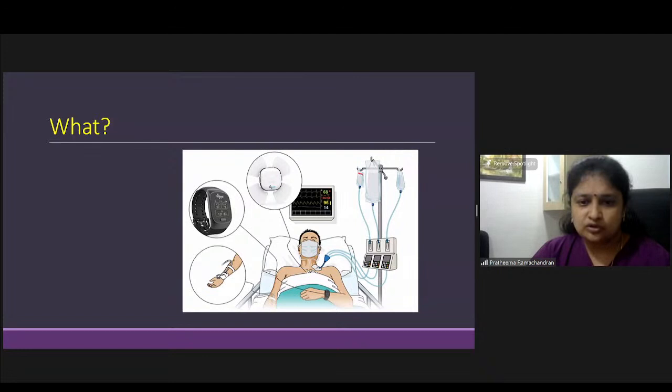If you look at a glance, it is going to be static. We don't know whether it is moving, whether it is in circulation properly. As Dr. Aarthi comprehensively talked about all the methods of hemodynamic monitoring, we basically use all these monitors only to see whether the blood is getting appropriately perfused and the tissues are getting proper oxygen, and vice versa. Are the tissues clearing off the toxic materials, is it coming back to the heart, going to the lungs, and is the blood getting purified? This is what we need to know in a patient.